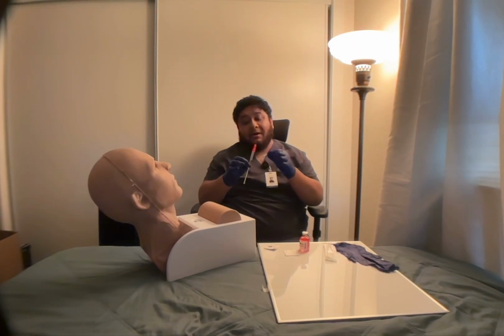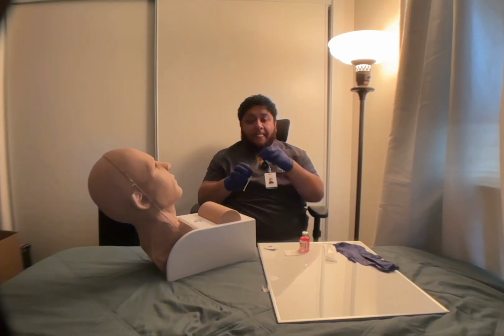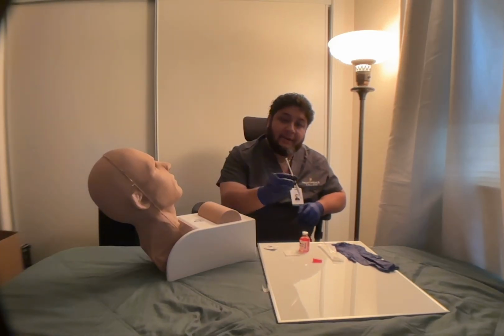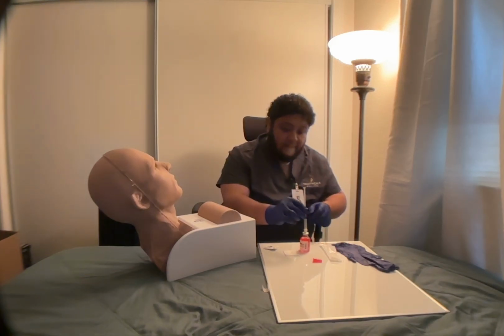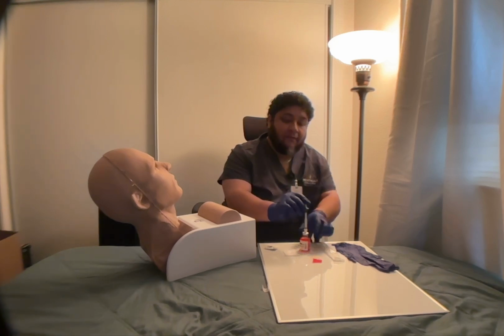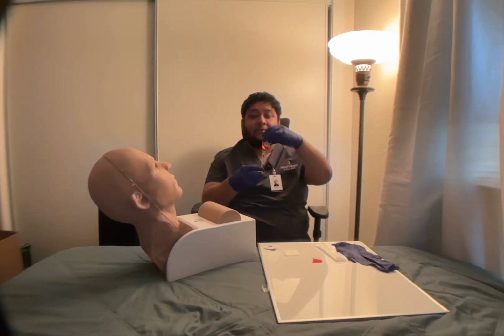Okay, once I've drawn 1 milliliter of air, I'm going to insert the needle into the medication vial. Alrighty, and now I'm going to push the plunger and administer the air into the vial. Once that's done, I'm going to invert the vial and draw the same amount, 1 milliliter.